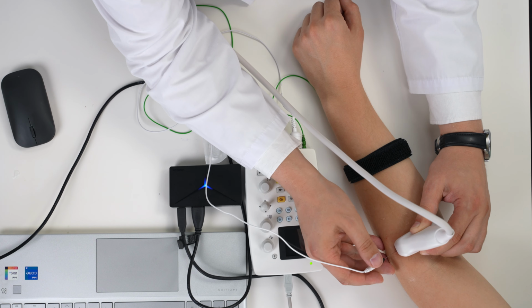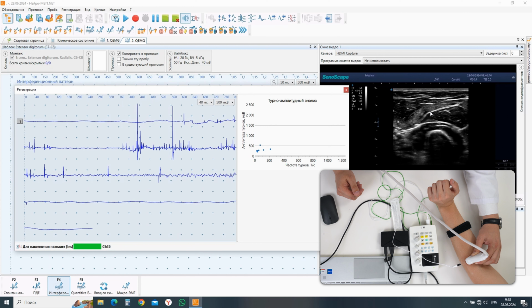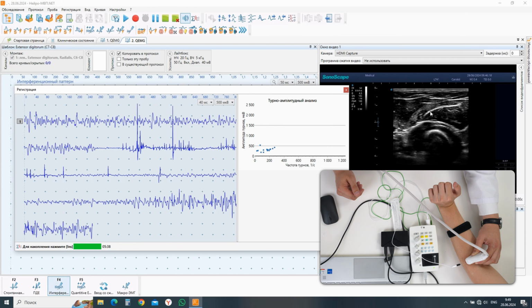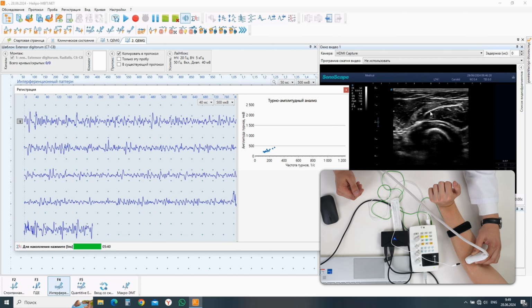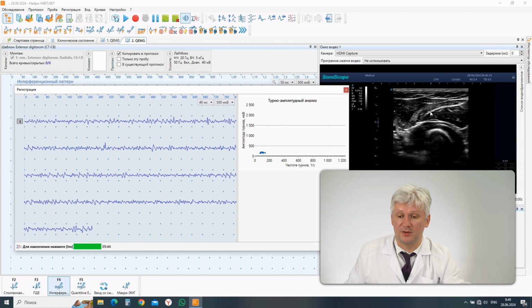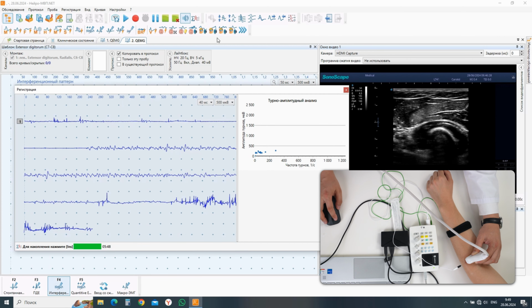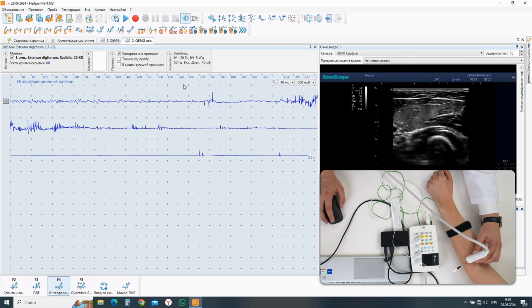I also got closer to a richer pattern. And it matches my more dynamic architecture of muscle contraction.